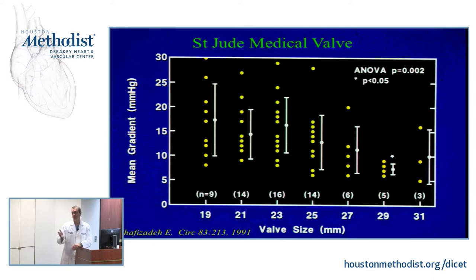So this is very important for the sonographers in the room. If you can get any data around the valve size, it's very important to give it to us. Put it right on the header. AVR is useful. It's more embarrassing than saying AS eval, and then we write moderate stenosis, and then the surgeon calls us and says, I did a bioprosthetic AVR 2 weeks ago. You dummy in the echo lab. Why didn't you tell me that? Sometimes it's hard to know.